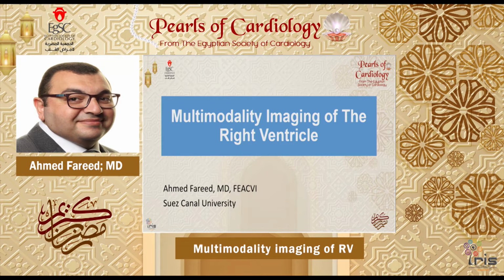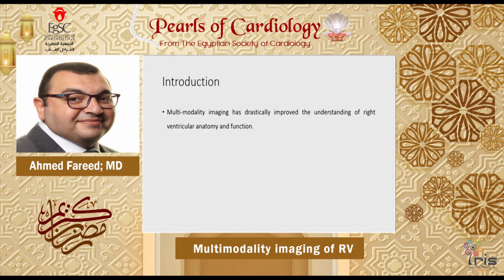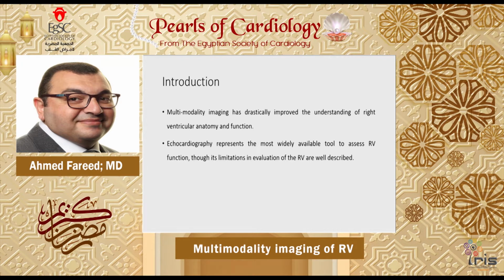The topic of today will be the multimodality imaging of the right ventricle. As we all know, multimodality imaging has drastically improved the understanding of the right ventricular anatomy and function. Echocardiography represents the most widely available tool to assess the right ventricular function, though its limitations in evaluation of the right ventricle are well described. The innovation and the rapidly growing CMR and CT offer volumetric assessment of the right ventricle with high spatial resolution.